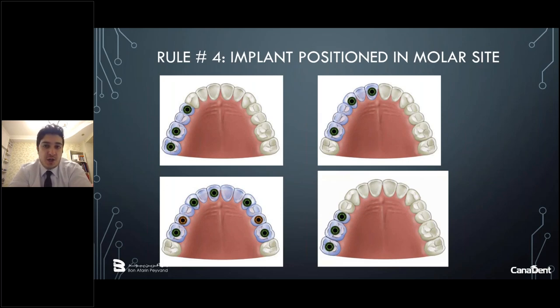That is so essential that even if you want to replace second premolar, first molar, and second molar, we may need three fixtures. As you can see in the right pictures, we have drawn a circle around it. We cannot put a pontic on the molar region. We must replace it. We cannot reduce the cost in any matter that we jeopardize our treatment planning.